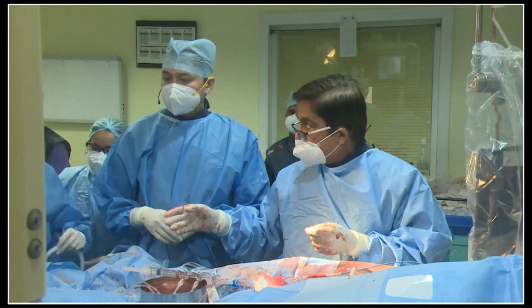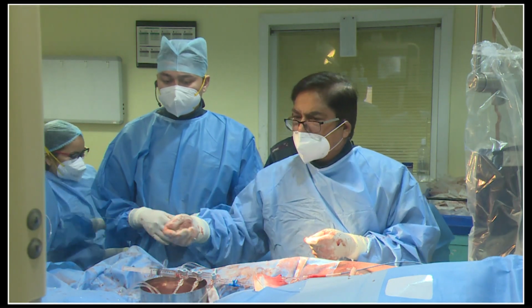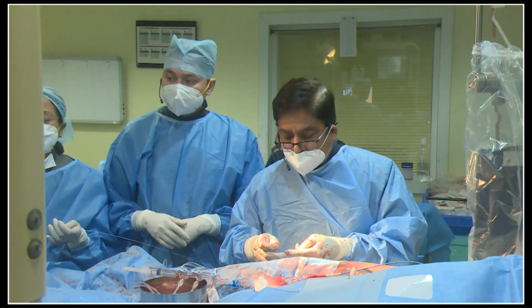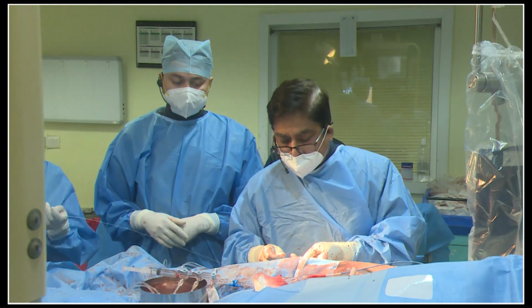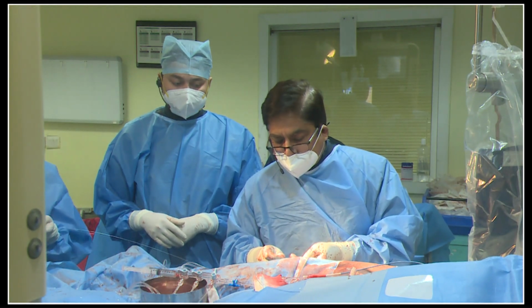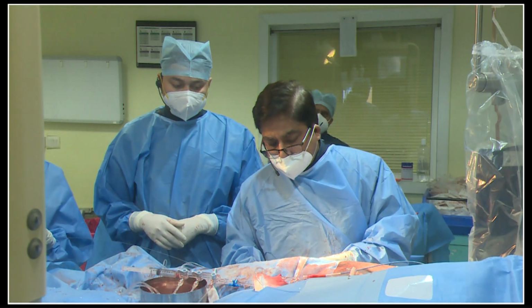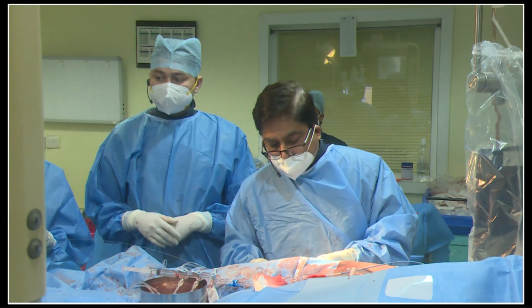2.5, 12. So what's our anticoagulation strategy as yet? Basically, I've checked, ACT was 451. Okay. If you want, I've given 1000 more. Okay. Actually, Goel sir, will you remove the left catheter now? Yeah, I will. Let me just dilate this one, and then I will remove. Correct. Because then people will be moving the other catheter, creating a problem. Certainly. You can keep the BP monitoring from the sheath itself.